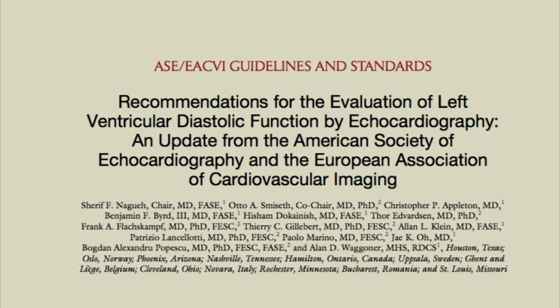Let's come to the major topic of today, which is diastolic dysfunction. And there is actually a reason why we chose this topic. These are the guidelines which have been issued by the American Society of Echocardiography jointly with the European Association for Cardiovascular Imaging. After, I think, 2009, finally they revised the guidelines, and there's a lot of information inside.